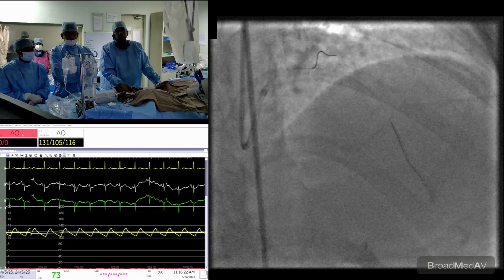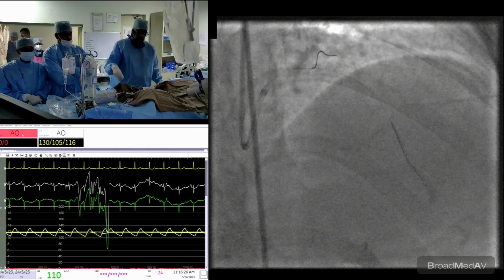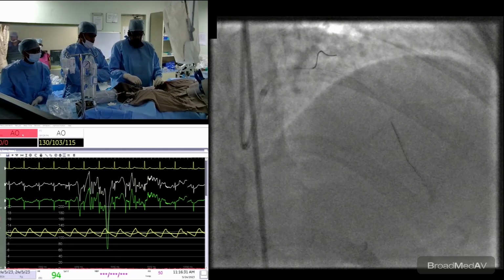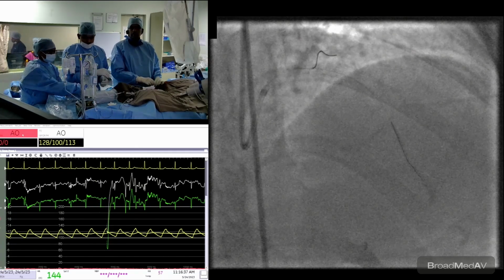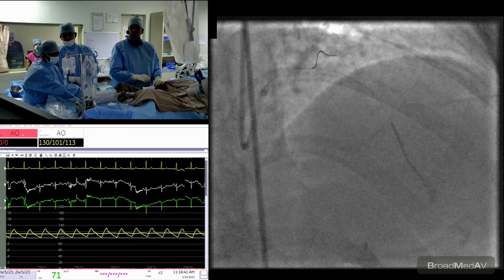And the proximal edge, how it is expanded. Since it is a 28 millimeter stent, I think maybe we can divide the stent into two halves, before the diagonal and after the diagonal, and we can measure the expansion. And at last, we are going to see the ostial LAD, whether during this catheter manipulation, any block has got disrupted or not.